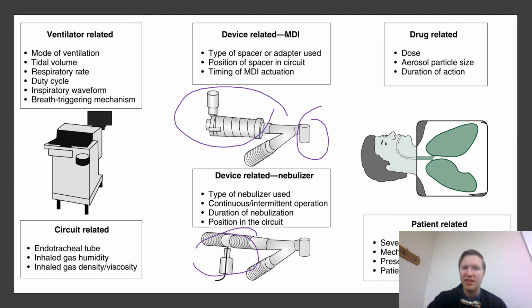Even when we're looking at the circuit down here, is there humidity on the ventilator being used? If not, we need to take out the HME, right? So you're breaking the circuit for that, which could be potential loss of air causing atelectasis, potential risk for infection, because eventually you're going to have the nebulizer or MDI end, and then you're going to have to put that HME or a new HME back in.